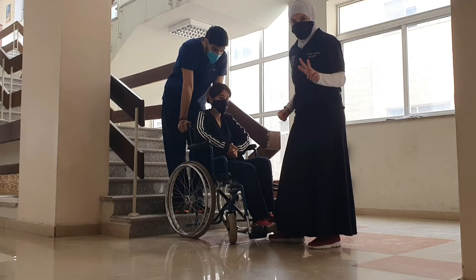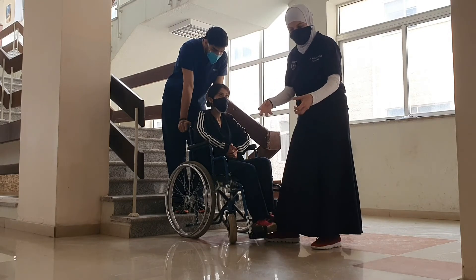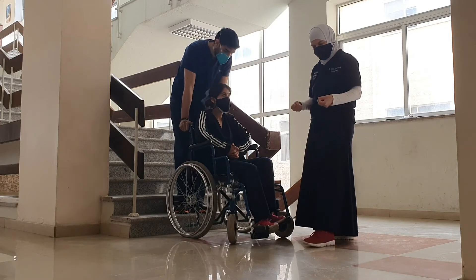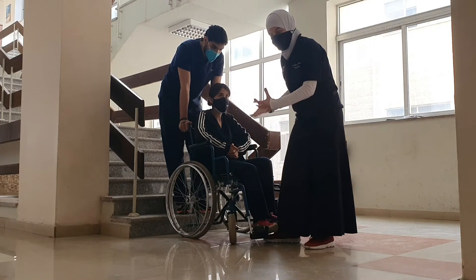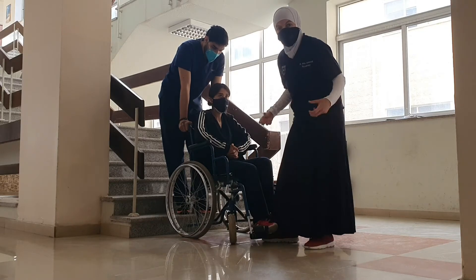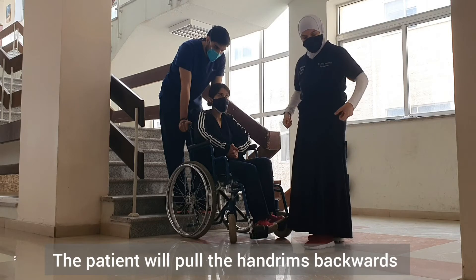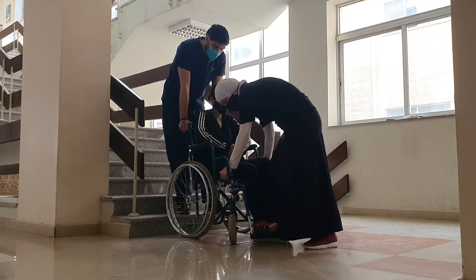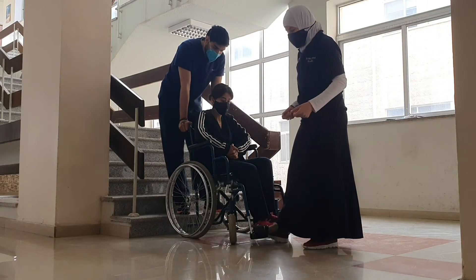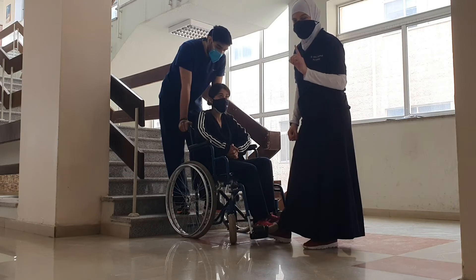On a count of three, the person behind will be holding the push handle and will push up. The person on the wheelchair, who is the team leader, will do the count and will pull on the wheels backwards. The person in front will assist by holding the frame. It will be a coordinated effort and we will do one step at a time.